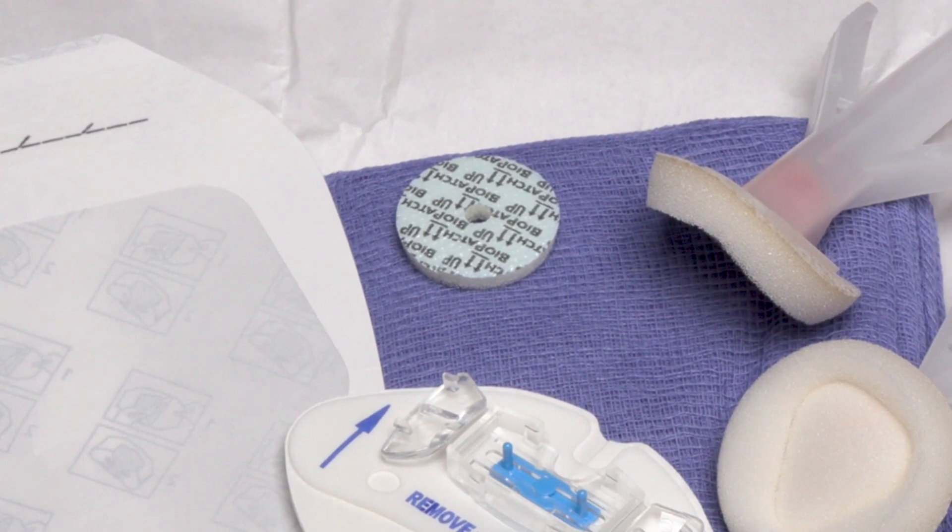Because I am dressing a central device I need a chlorhexidine gluconate impregnated dressing. This dressing is designed to secrete a small amount of chlorhexidine gluconate while it is in place over the insertion site, providing antimicrobial protection against microorganisms and thereby reducing the risk of bloodstream infection.